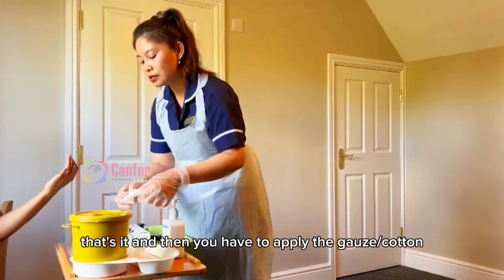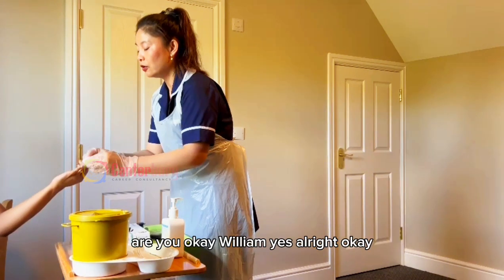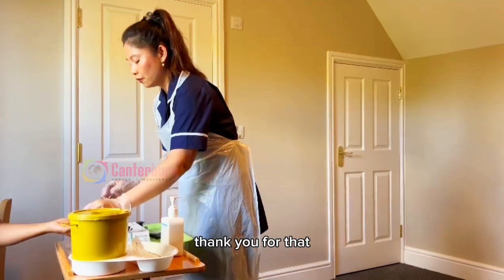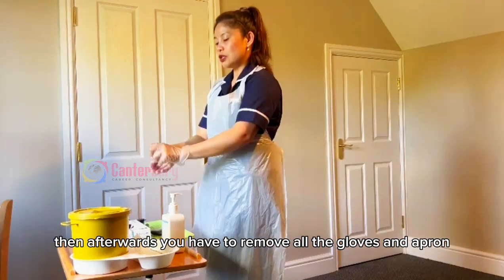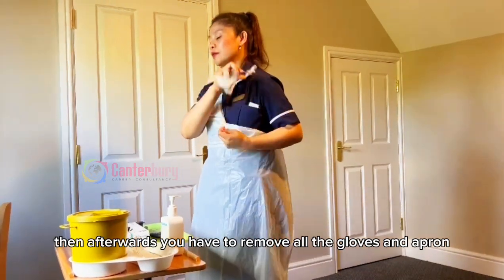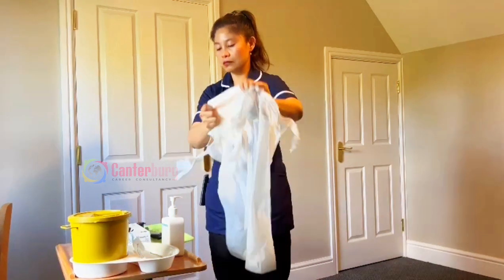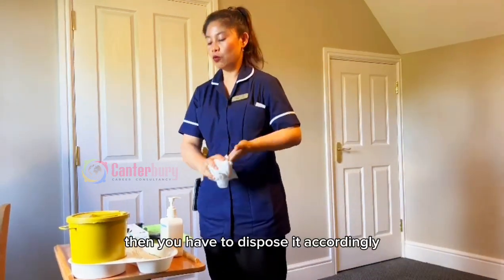You have to apply pressure because as you can observe there is some bleeding there. Are you okay, William? Yes. Thank you for that. Afterwards, you have to remove and dispose of your apron accordingly.